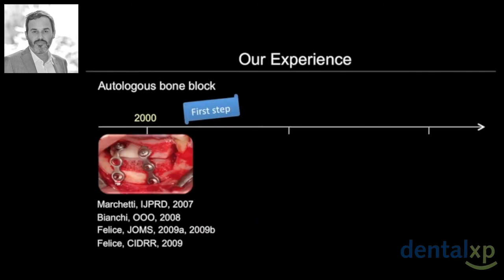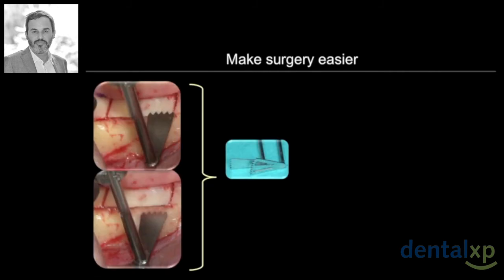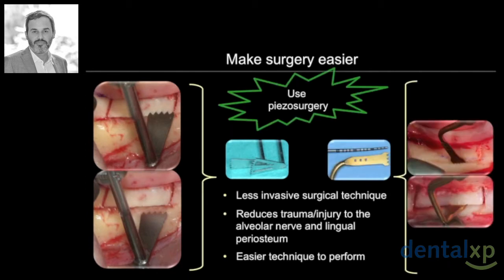Now, seeing the potential of the inlay technique, our aim is to improve it, to make it simpler, safer, and reproducible for all operators. What does this mean? When I started the technique, it was carried out with traditional instruments. Today, I use piezosurgery, and this has made the technique easier to perform and less traumatic for the patient.